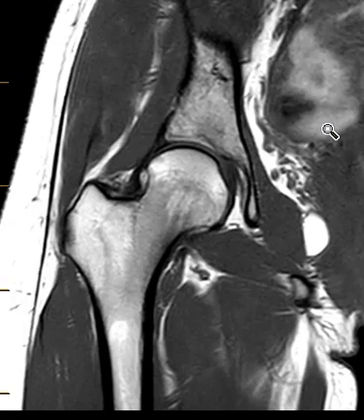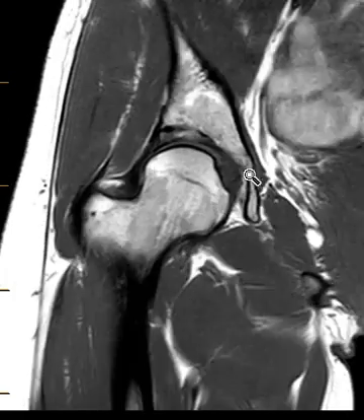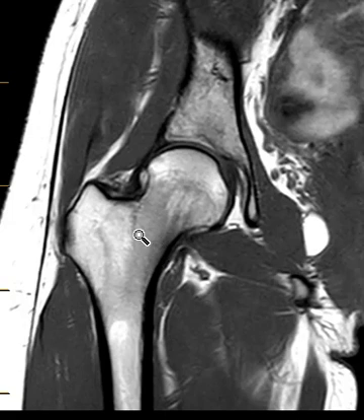This is a coronal T1 weighted sequence, and things look pretty good. The femoral head is nice and round, the acetabulum looks good, the marrow looks pretty good. This dark area here just looks like a place where there's more red marrow than fatty marrow. So at first glance things look very good.